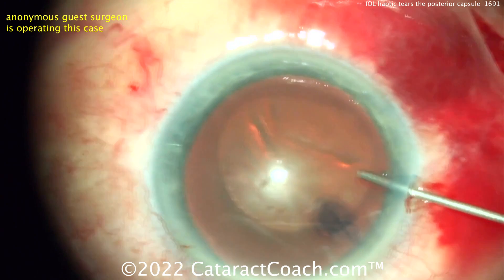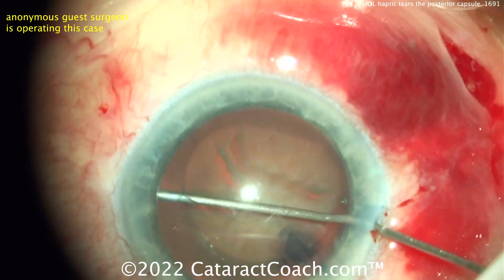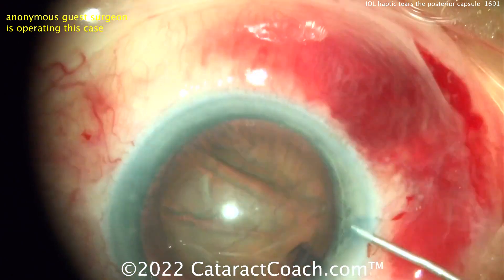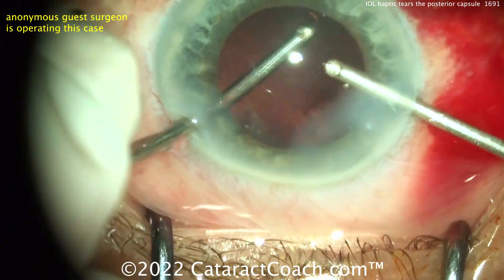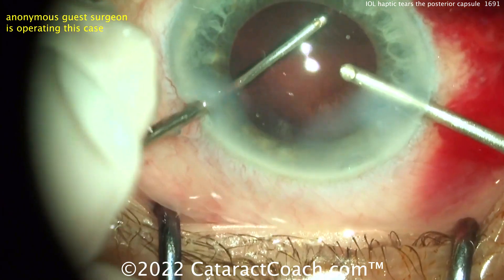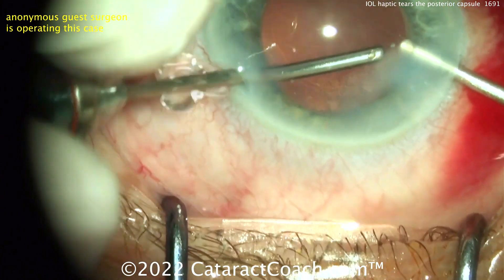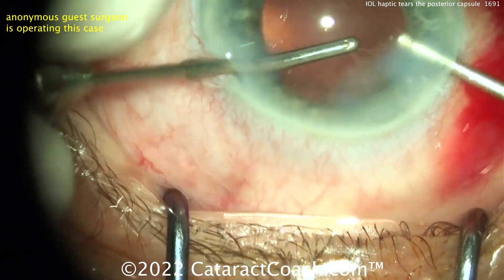This rhexis is not exactly centered but it's not terrible — I'll take it, it's reasonable. The issue is going to come at the end of the case. You can see how it's decentered and not the ideal size. Cleaning up the capsular bag by manual I&A — a very nice clean capsular bag, posterior capsule intact. You think, hey, I'm home free, right?